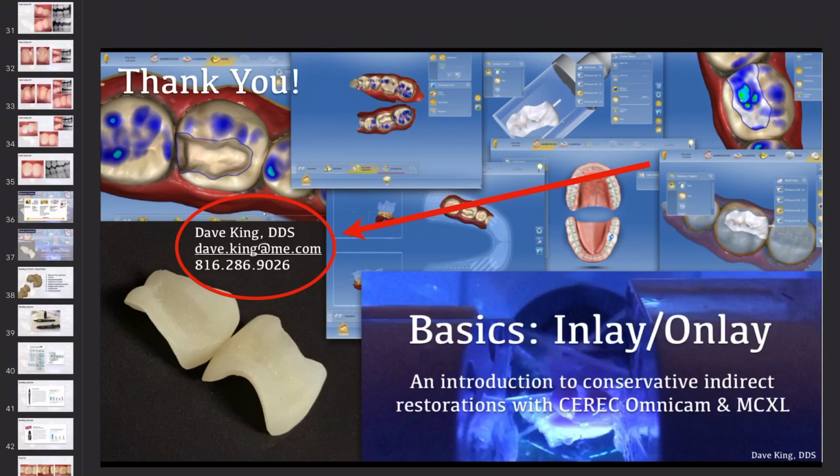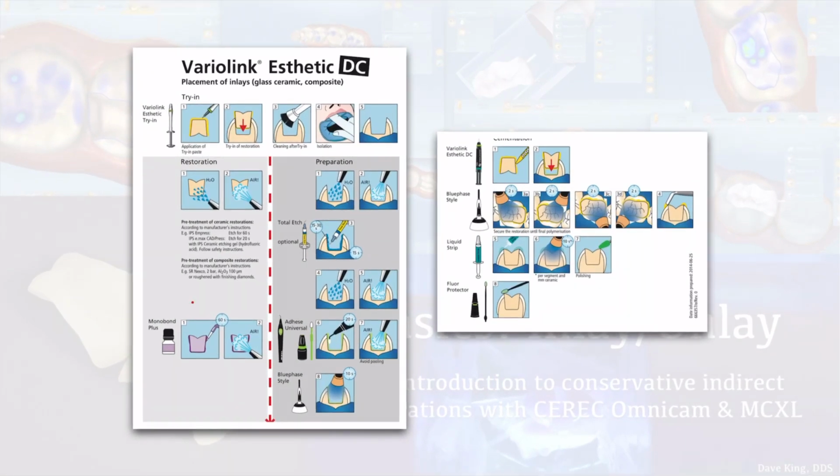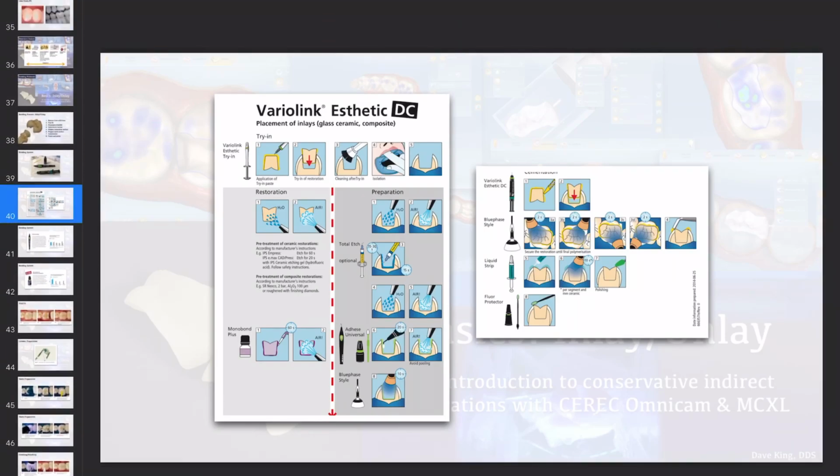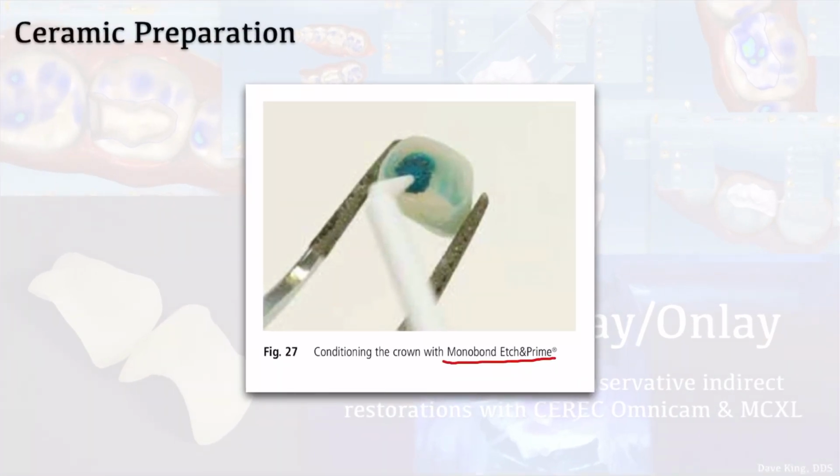I think getting back to this one, let me hit play here again. This, I put in Monobond Plus. I chose the wrong instruction sheet, but it makes sense. And if we go forward to this conditioning step, this should be the etch and prime. So just remember Monobond etch and prime, 20-second scrub, 40 seconds of reaction, and then rinse it and dry it until it's bone dry. And all this kind of greenish turquoise color should go away.